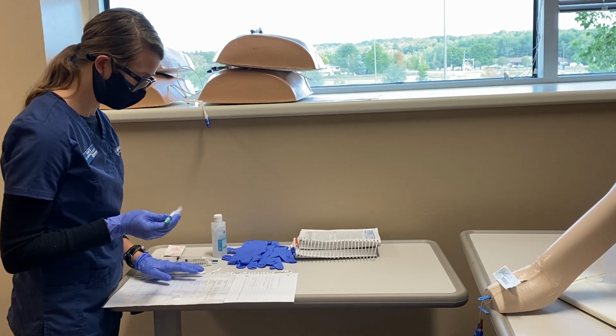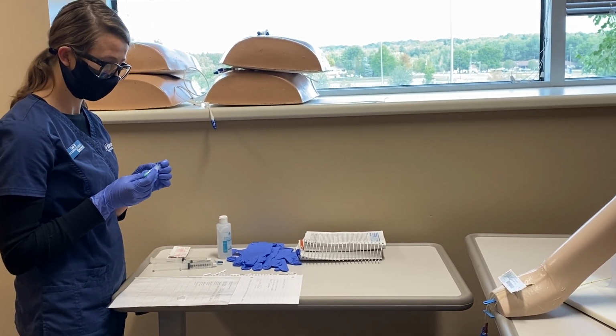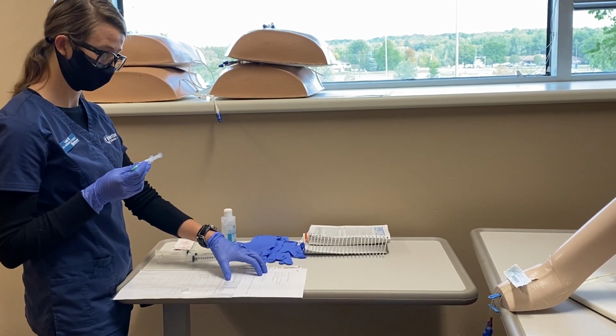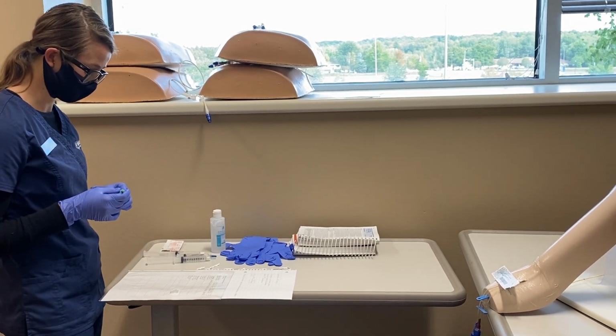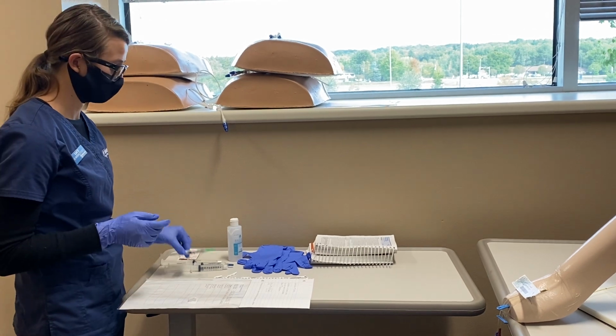I have ordered here 1 milligram, and I have a syringe of 2 milligrams per 1 milliliter. After doing a calculation, you'll be getting 0.5 milliliters today. I'm going to be giving it IV push every 3 hours for pain, but since you have yet to get it today, you're due for it now.